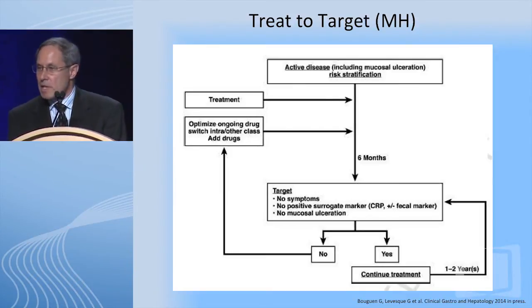This algorithm depicts a treat-to-target strategy using colonoscopy as the tool and mucosal healing as the target, and is a paradigm that is being increasingly used in Crohn's disease and other conditions.